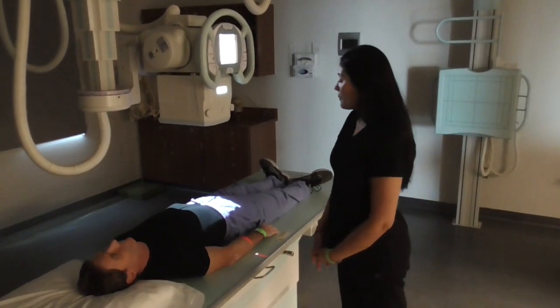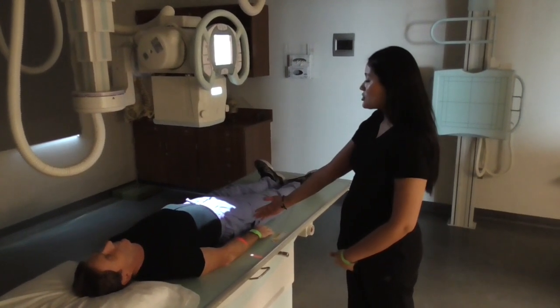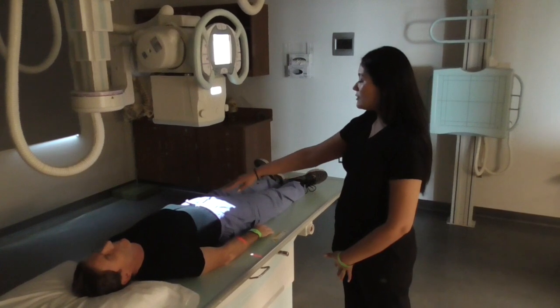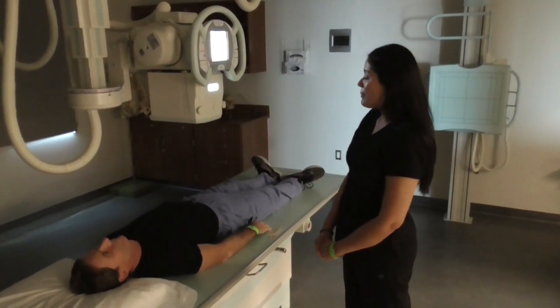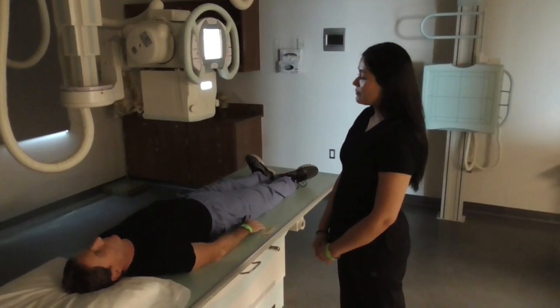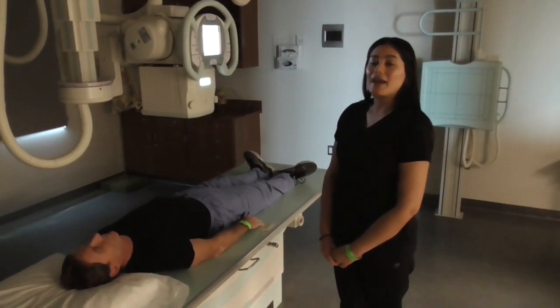And that is my KUB. You want to make sure that you include the pubic symphysis, kidneys, ureters, and bladder. I would have my patient take a breath in, blow it out, hold your breath out, and expose.